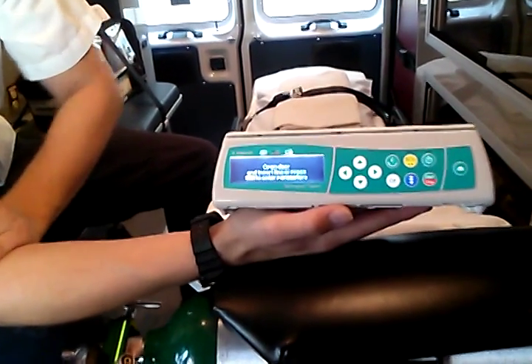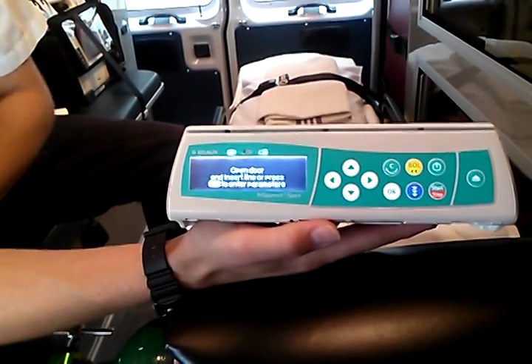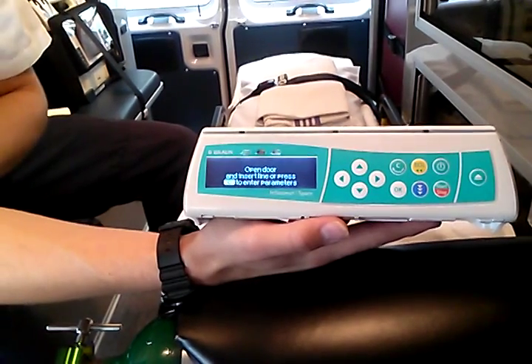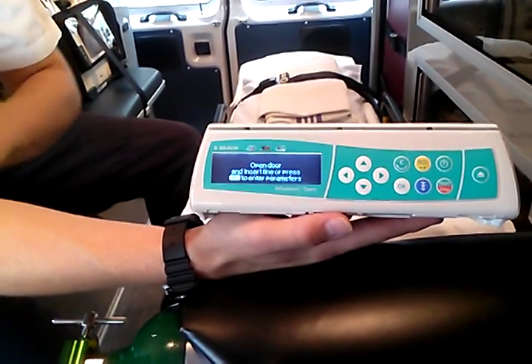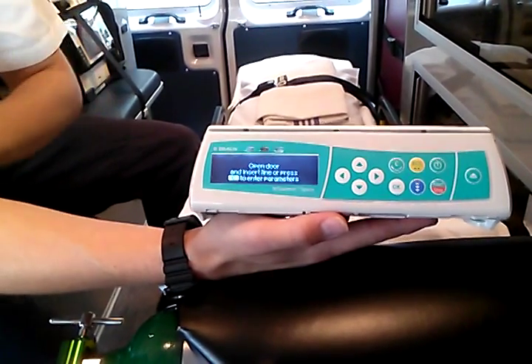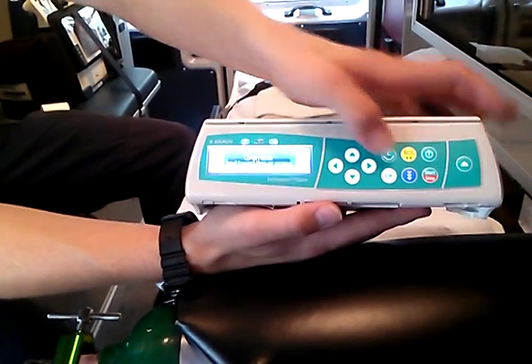It's going to say 'open door and insert line' or 'press C to enter parameters.' The first thing we're going to do is put the parameters in first, because your patient's likely already on a pump right now. No reason to put the line in first. Let the patient keep getting the medication they're getting while we get everything set up. So we're going to press C to put the parameters in first.